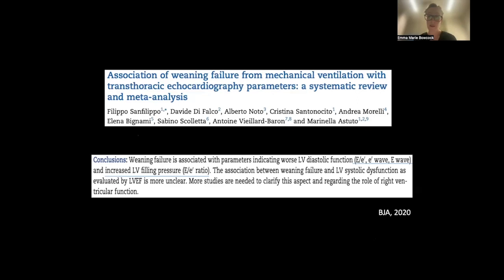And there is pretty good evidence to back this up, with Sanfilippo being the godfather of all things diastology and crit care stuff, isn't he? They showed in this meta-analysis, I think it was about 11 studies, I can't quite remember, that patients with lower E prime values, higher E wave values, and so higher E to E prime ratios were associated with weaning failure, much more so than LV systolic dysfunction. There were no cutoffs they could derive from these studies, but in some of the individual studies, E to E prime values of around 14, 15 and above tend to be more associated with weaning failure. And maybe more studies in this area are needed, I think.